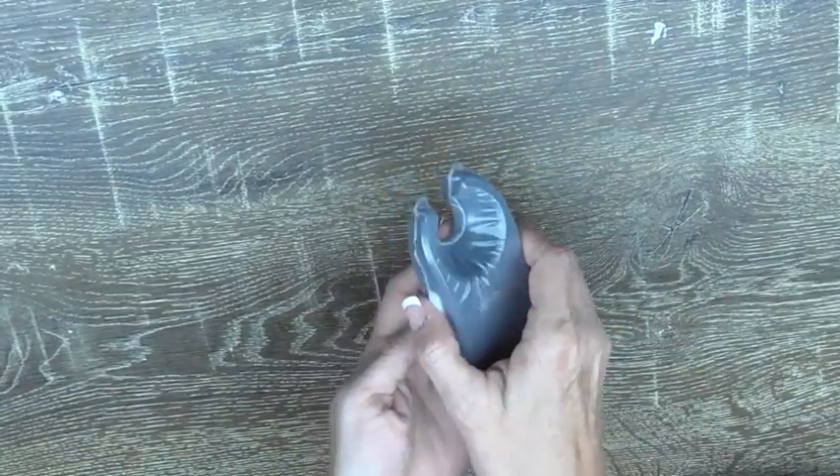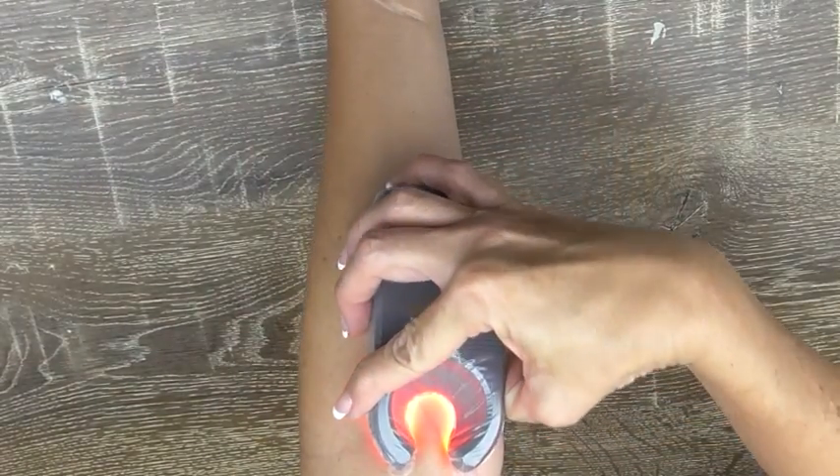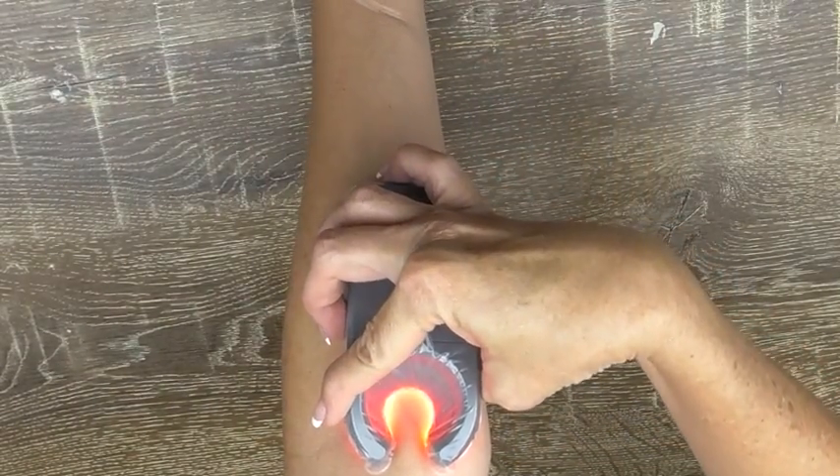It makes finding veins really easy. I quite like it. Definitely worth the investment.